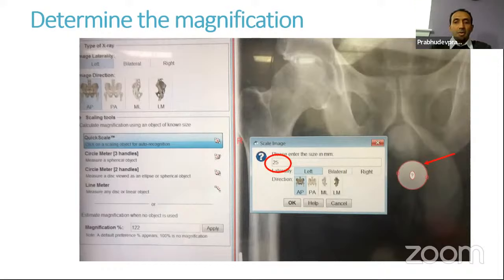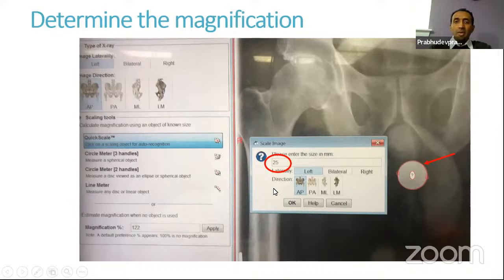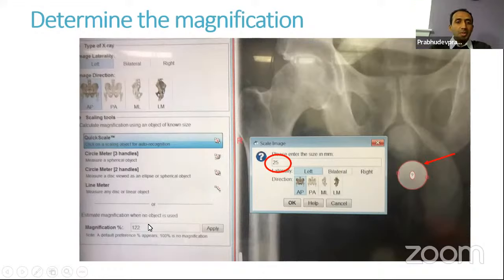You can click 'Quick Scale' and the software identifies the marker, then you tell it the marker size — typically 25 millimeters — and it sets the magnification for you. If the software doesn't identify it automatically, you can drag the application manually to do the appropriate sizing. If we don't have any marker, the standard magnification of about 20 to 22% works well most of the time.